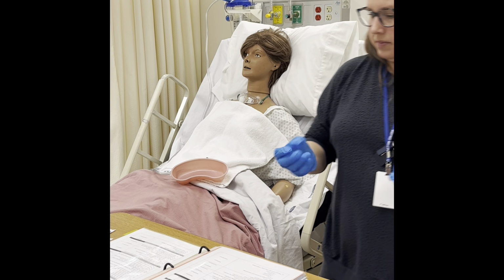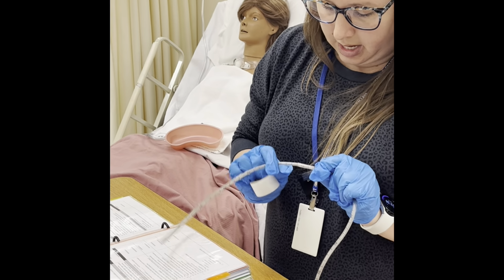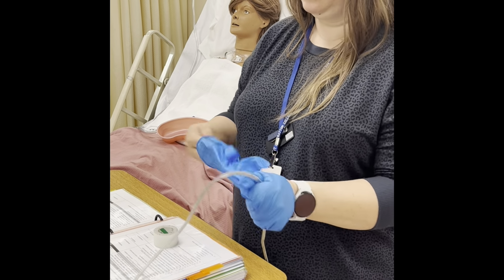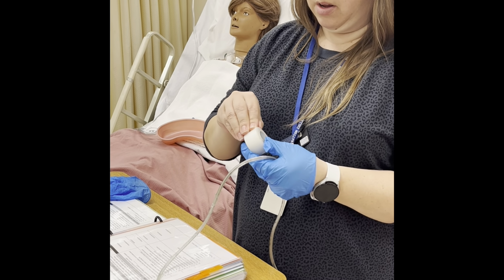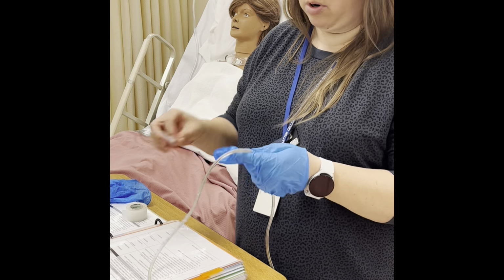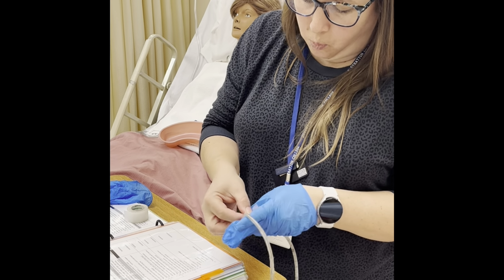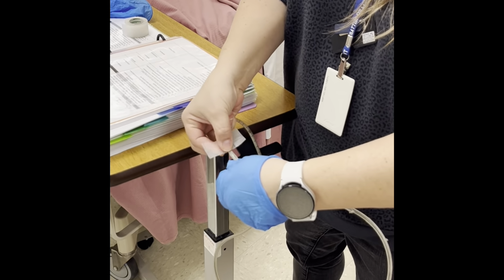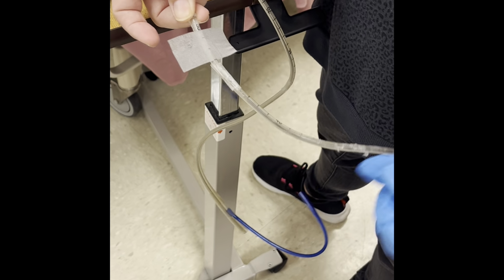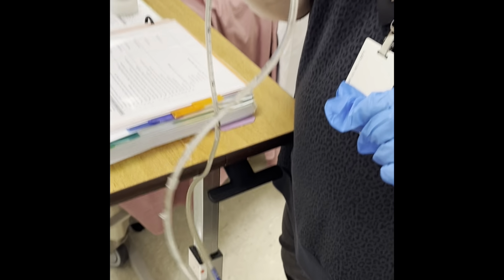So we're gonna mark this. Somebody already has a piece of tape here and it's actually marked in the wrong spot. So we're gonna mark it. We'll say this measurement is 52 centimeters, roughly. These extra large gloves are not working out right now. I'm gonna take a piece of tape. Normally we take a surgical marker to mark it because who wants a piece of tape hanging out their nose? We're gonna put it right here with the tape marking the number and then going towards the numbers that are gonna stay out of the patient. So the number that's gonna go in is where the tape starts and where the numbers aren't. And we're just gonna make a little flag.